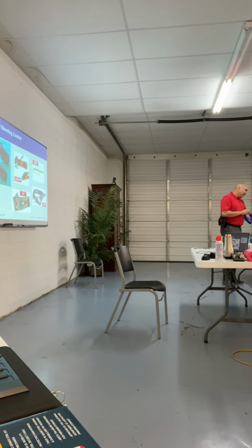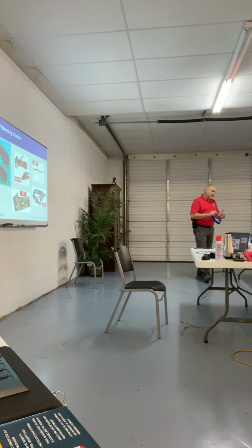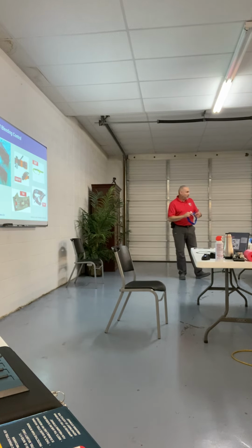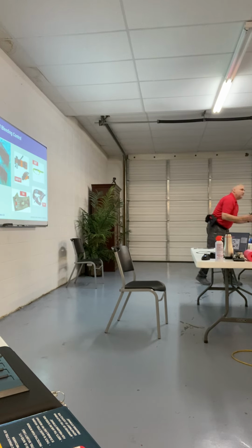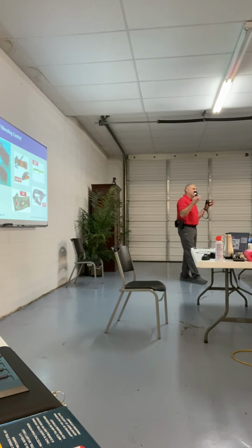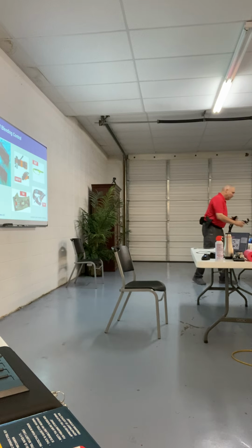I was looking at this plate. There's no embossing on these, right? Right. But on a real CAT 7, you're going to have CAT 7 on there. There'll be embossing. It'll have the patent number on there. It'll give you all this information. It's like those N95 masks. Bingo. All right? So, these look like the same tourniquet, right? But they're not. They're not the same.